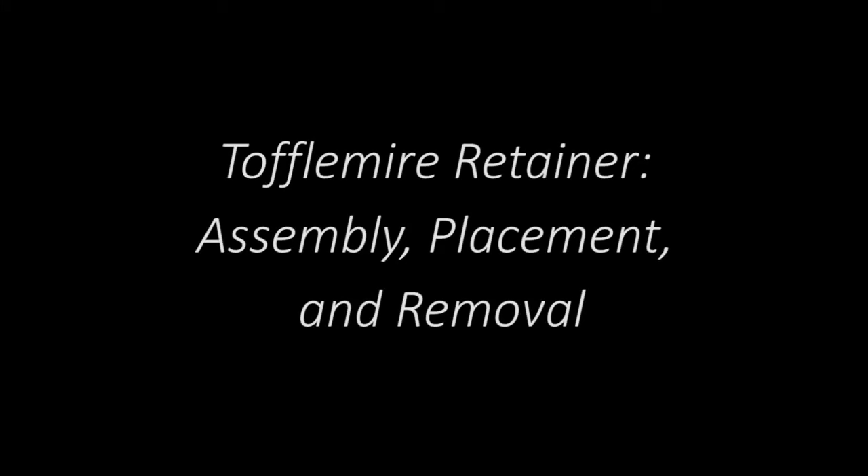Tofflemire Retainer Assembly, Placement, and Removal. In order to prepare and place our Tofflemire matrix system, we will need the following materials and supplies.